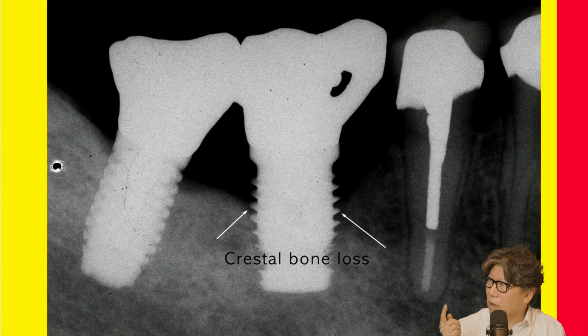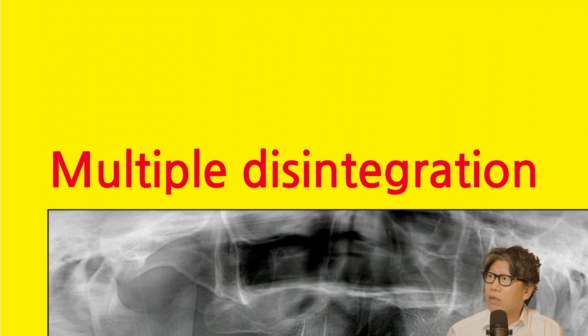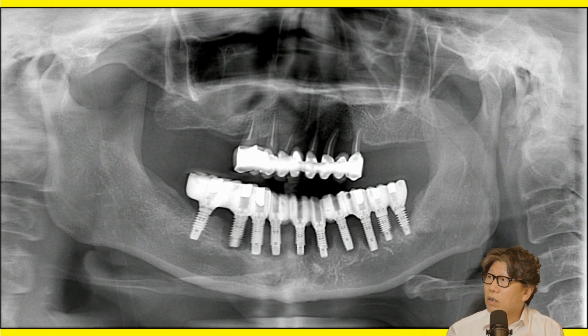I remember this one. This is a patient of mine. What happened to this one is I put a thick implant fixture in too thin bone. It's a knife edge, and I put a thick one in. I got greedy. That's what happened. And then this is my patient now. I put in 10, and 9 fell out. It's frustrating. It's a Biohorizons implant. This is a failure of implant design, in my opinion.